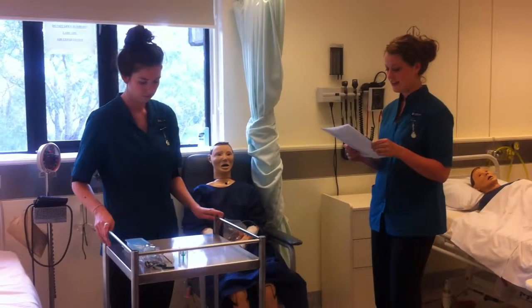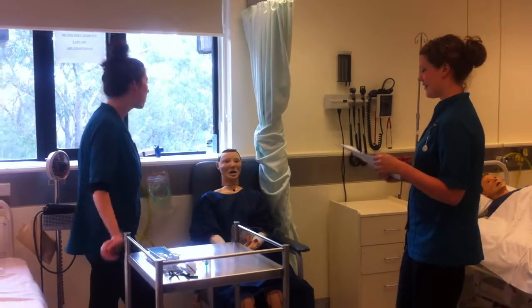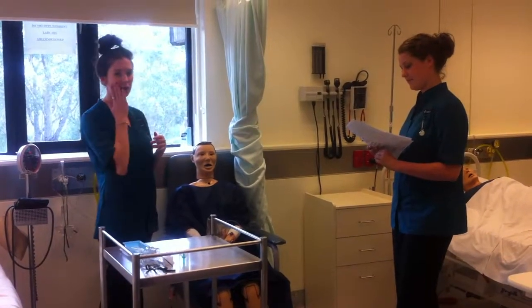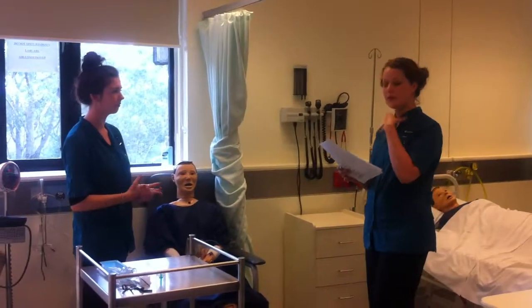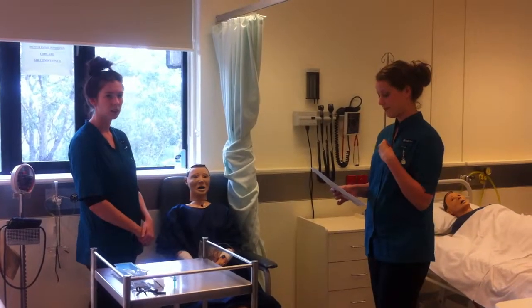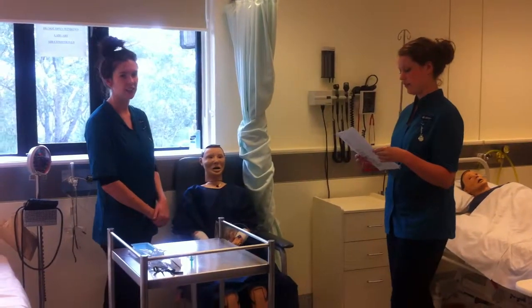Okay, so you're advising to do this now? Oh yeah, because if the drug was a steroid, just advise the patient to rinse their mouth and wash the face around where the mask was, because the drug can cause an irritation to the mouth or skin around the mouth. But in this case, it's Ventolin.